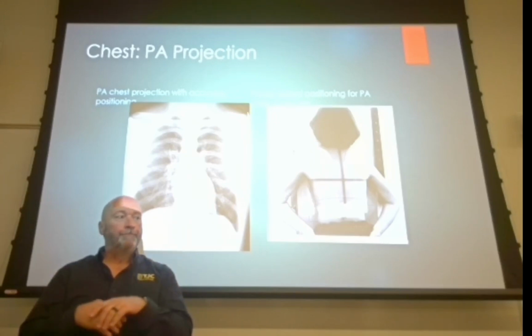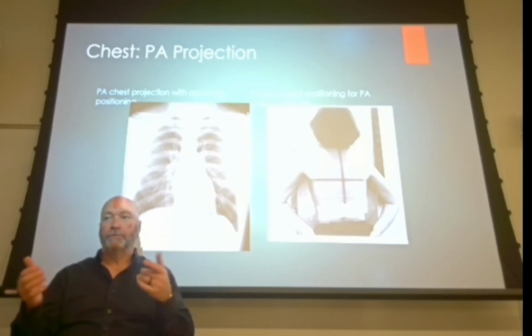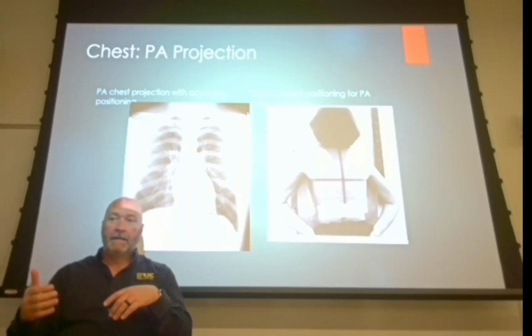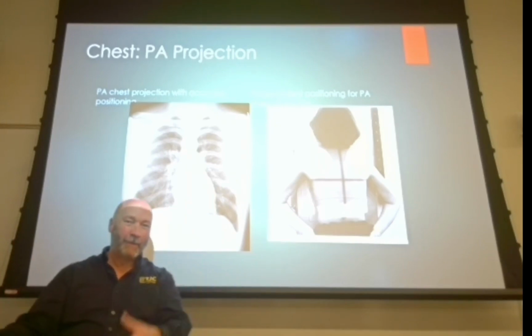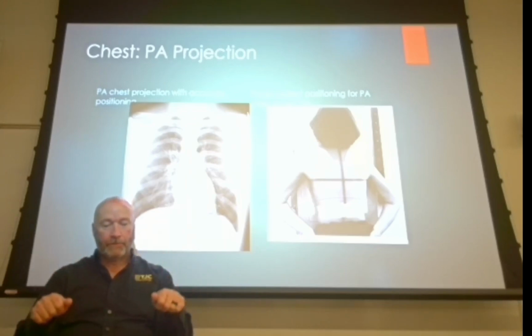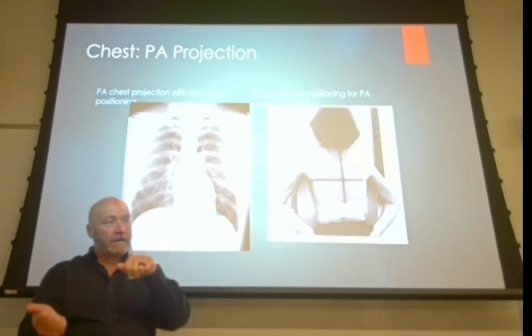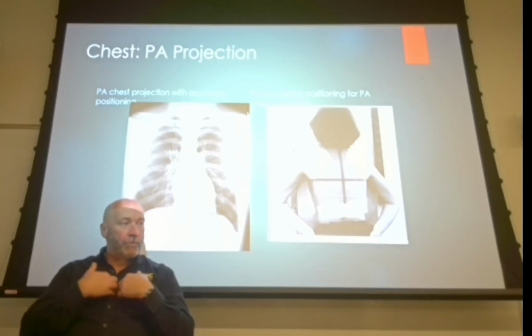I've worked in hospitals where it's almost routine on portable chest x-rays to shoot 40 inches. Really don't recommend that. You're going to have more flexibility in your positioning if you shoot at the foot of the bed, instead of dragging the tube right across the patient's knees. I don't mean truly right across them, but just above the patient's knees. You can just drive the portable to the end of the bed and kick the x-ray tube up without really moving it aside from just straight up and down, right? So what you want to do is angle to the patient's sternum for your portables.